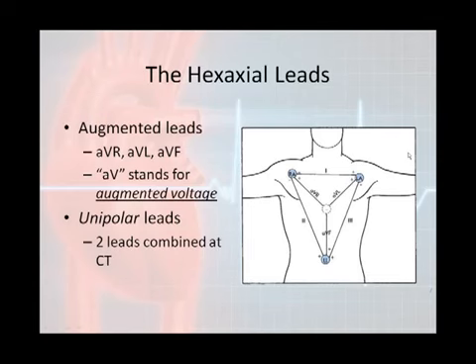Now these are considered unipolar leads because there's only one physical pole or one physical electrode on the body, and that's the positive electrode. The negative electrode is not a real electrode, it is actually the heart. That's what they consider the negative electrode.